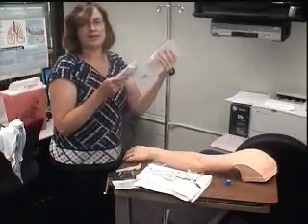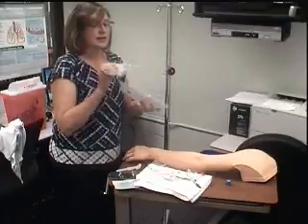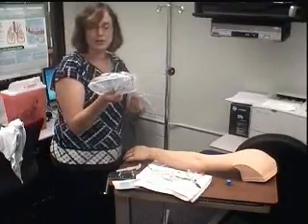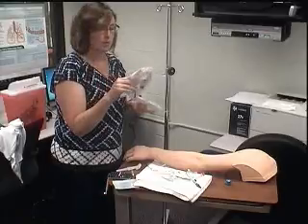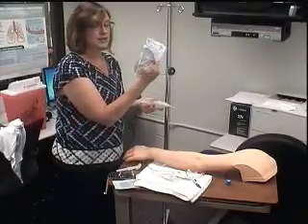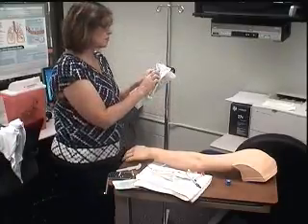It was normal saline at 75, so I make sure I have my normal saline, and I need my tubing. It could be pump tubing, it could be just regular tubing. This is just going to be a regular tubing, and I'm going to hang this like you guys did in lab already. So this is going to be continuous flow tubing.